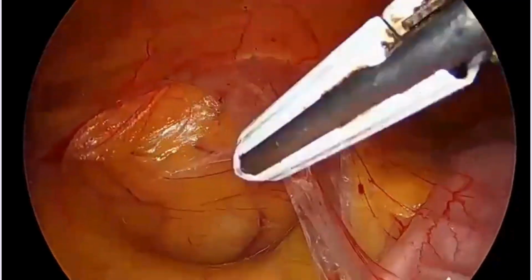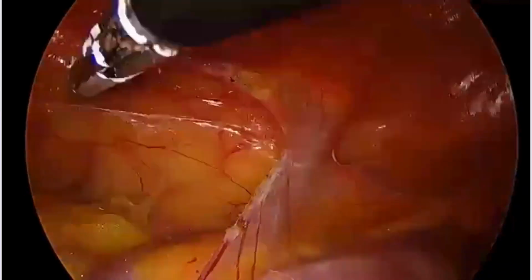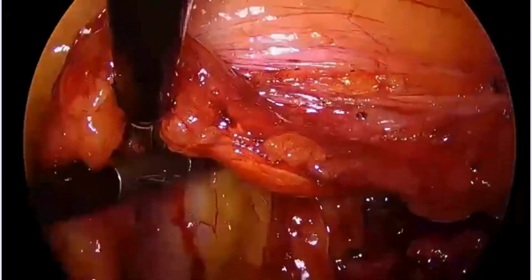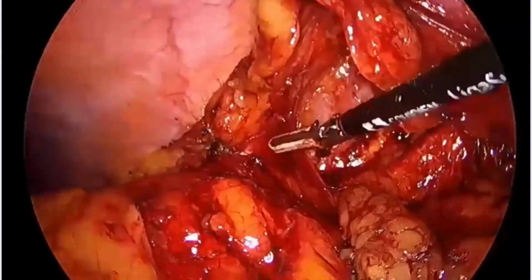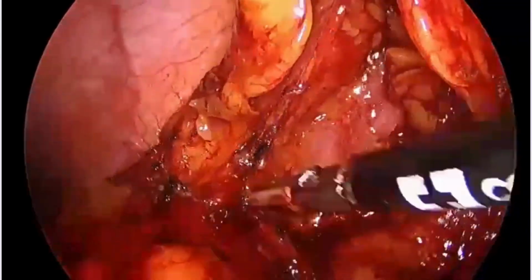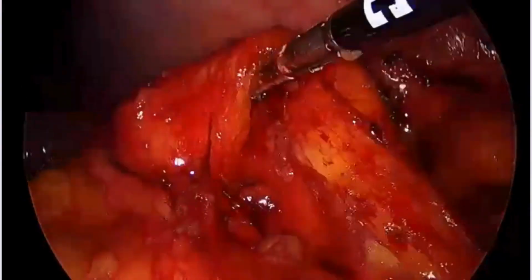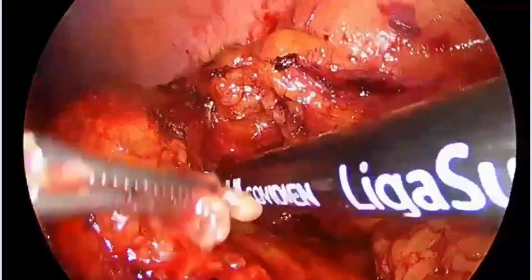This is the case of multiple recurrent renal calculi leading to a non-functioning kidney on the left side. This is a 55-year-old elderly lady with a history of one open pyelolithotomy followed by two abandoned PCNLs and one PCN placement for pyonephrosis, and multiple histories of pyelonephritis in the past. So in view of a non-functioning kidney with a history of multiple episodes of infections in the past, we had taken up the patient for lap nephrectomy, and as expected it was not an easy case.